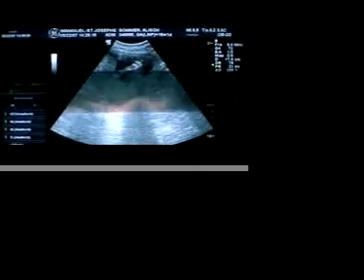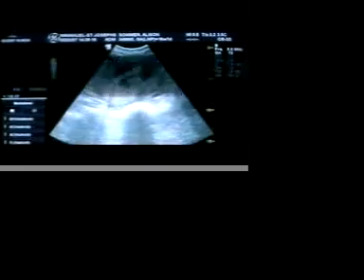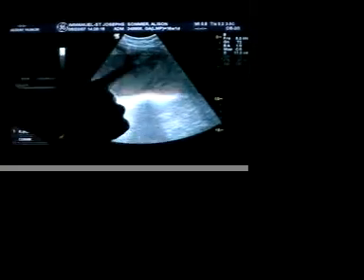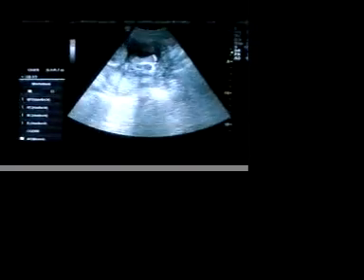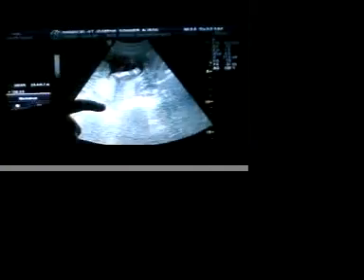Oh, look at that hand. Yeah, you can see that hand pretty good. You can see all the bones in the hand. Can't see the thumb in this picture, but let me move it forward a frame, we'll probably be able to see the thumb. You can see the start of the thumb down there. Oh, sweetheart. It's really okay to show us. Camera shot at 16 weeks. No kidding. A bent arm.